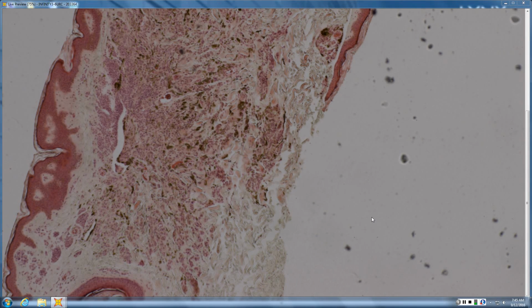And if you're looking at a high power field, if you're finding more than one mitotic figure, that's certainly trouble. And studies have looked. Some nevi do have mitoses. So if you look with PHH3, you have to get up around 6 before you're 100% in the melanoma category. But certainly atypical mitotic figures, deep mitotic figures are more worrisome with that.